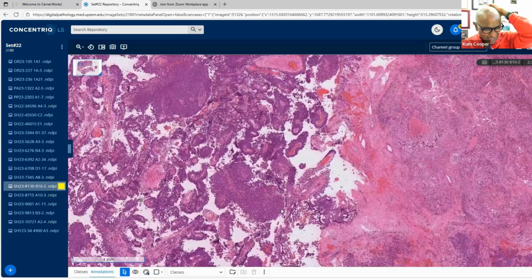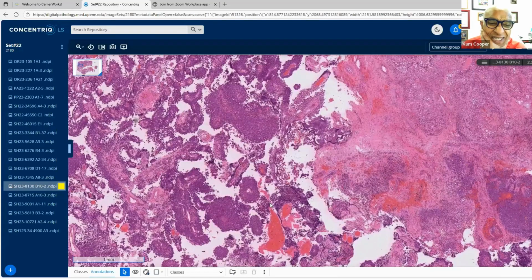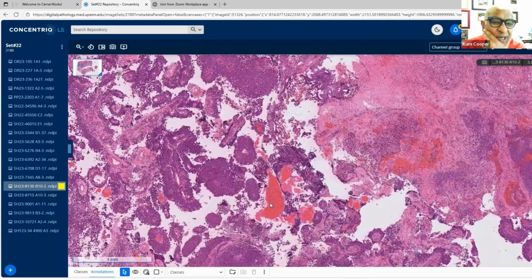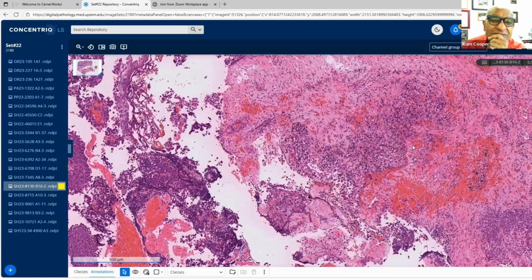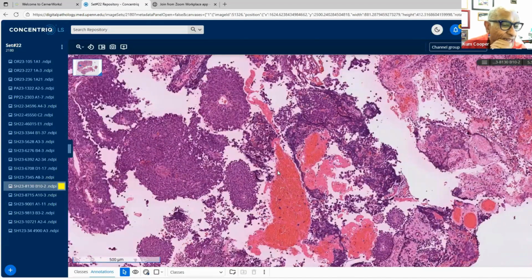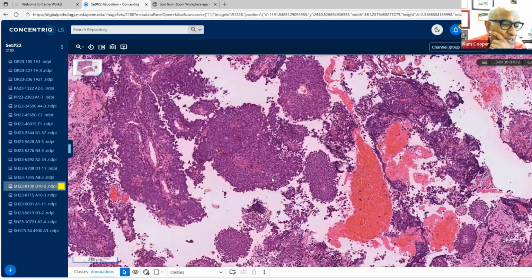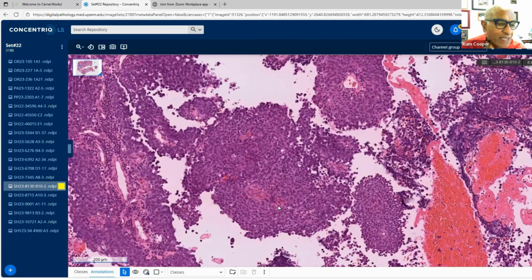Okay, anybody wants to take a stab? Go ahead. Any investigations that you want to start with? Happy to go, or if you have a differential. Okay, we're getting small round undifferentiated sarcoma. That's a great start. So it looks like small round blue cells.